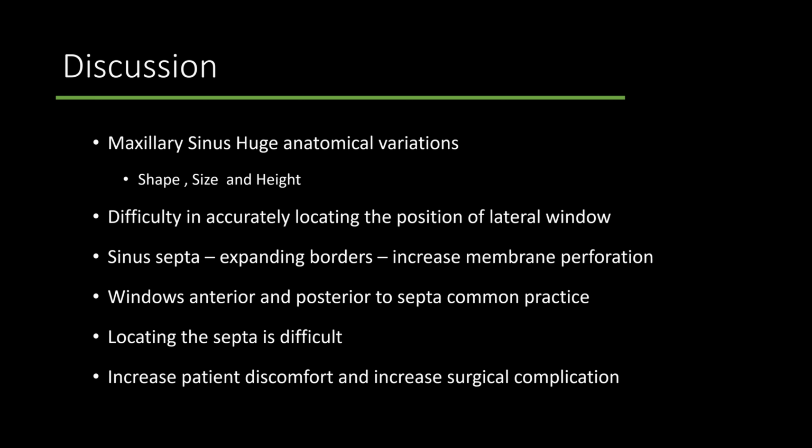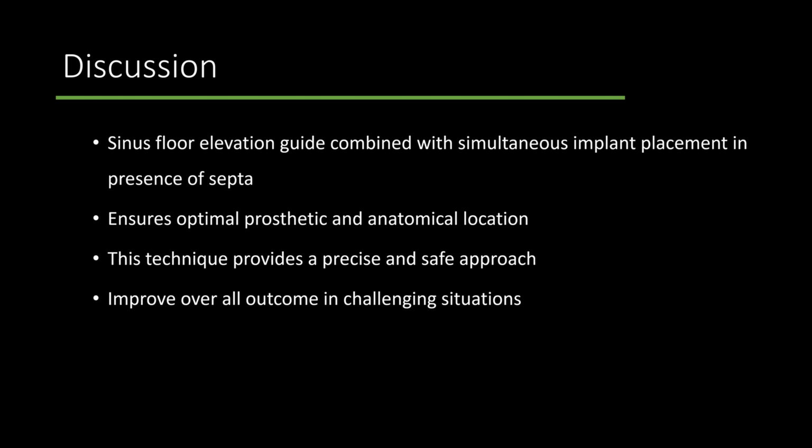duration of the operation. An individual surgical guide with virtual pre-planning for the sinus floor elevation was combined with simultaneous implant placement in the presence of sinus septa to ensure that the implants were placed in the optimal prosthetic and anatomic location. The resulting technique provides a precise and safe approach to creating lateral windows relative to the implant site and the location of the sinus septa, improving the overall outcome of implant-supported restorations for these challenging situations.